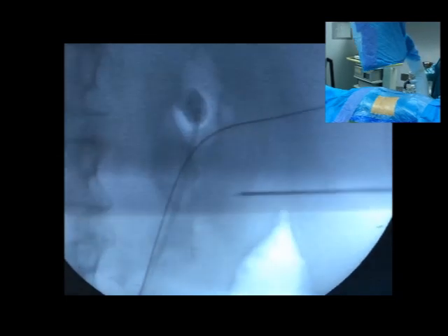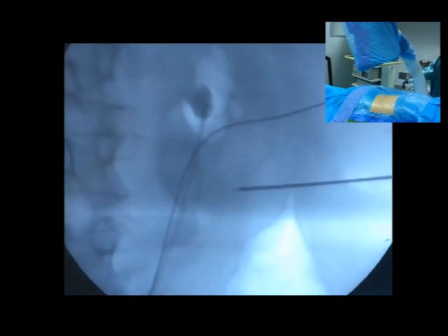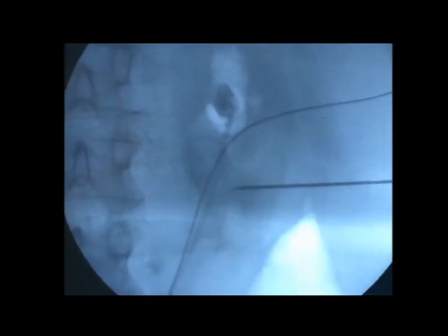The C-arm is repositioned 30 degrees towards the feet of the patient and the calyx is punctured. When the needle is in the calyx in both 90 and 30 degrees, we confirm the correct puncture.